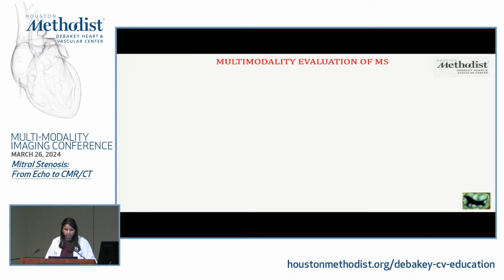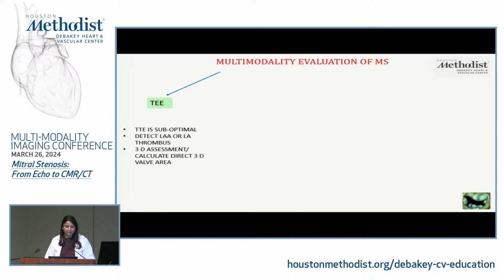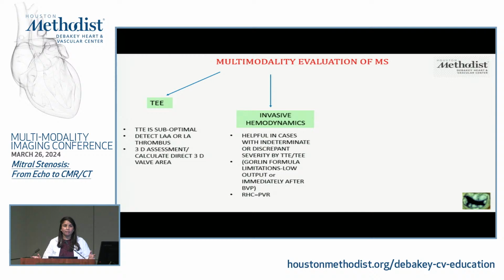Well, how can I not talk about our multimodality friends here? At the end of the day, I think we need redemption from my last talk, so I'm going to show that soon. But definitely, TEE, when TTE is suboptimal, and especially since we just talked about every patient of mitral stenosis having AFib, right? So I think we use TEE almost every patient to assess left atrial appendage for rhythm management. And I think that's very helpful too.